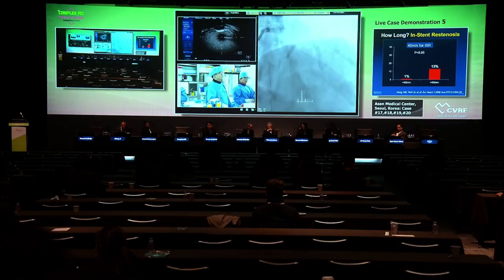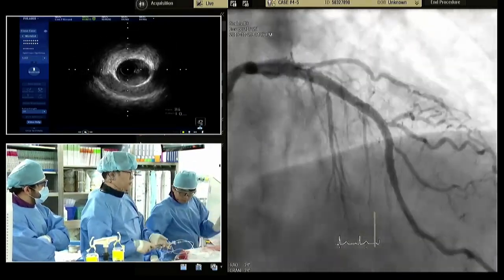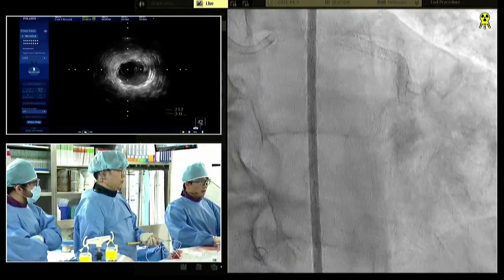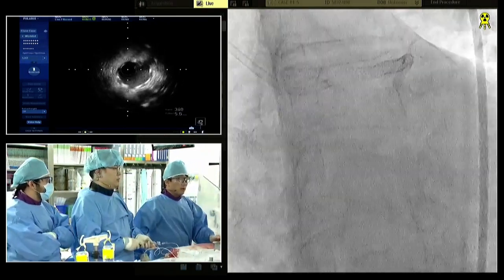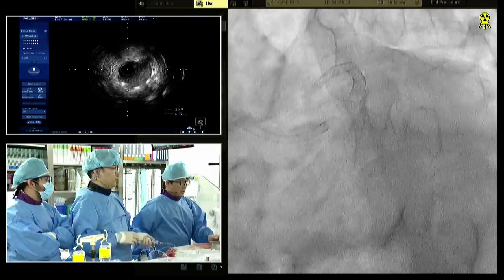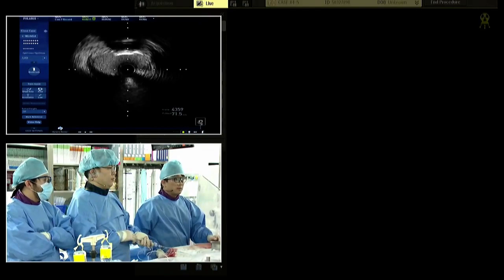It's great. Would you show us the left main part, in kind of a spider view? Okay. All right, would you check that one? This patient has a very short left main. Is it good? All right, great. And you can see by the IVUS that it's quite eccentric. The left main was quite eccentric. That is very nice.